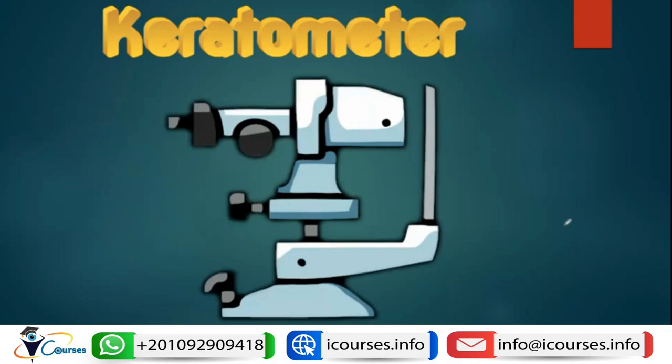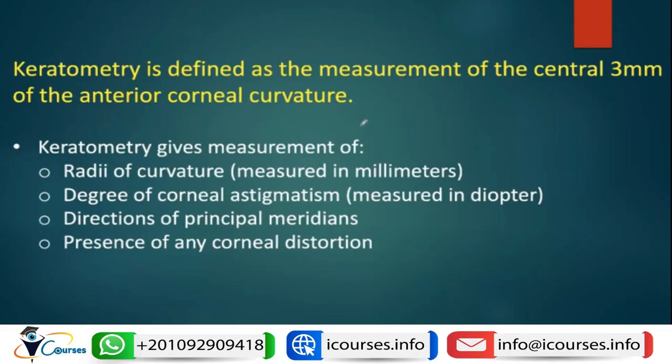Okay, so the surgical microscope is very simple, not much information about it, but here we come to another device that is important and there is a lot of information we need to know about it, which is the keratometer. So what is the keratometer? From its name, it is a device used for measurement of keratometry. And what is keratometry? It is how curved the cornea is.